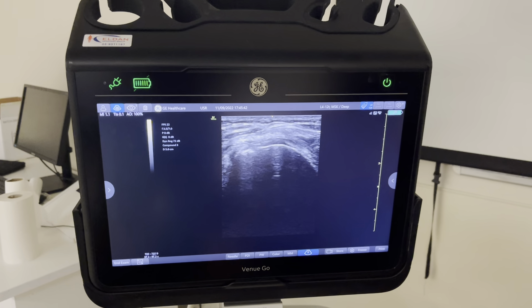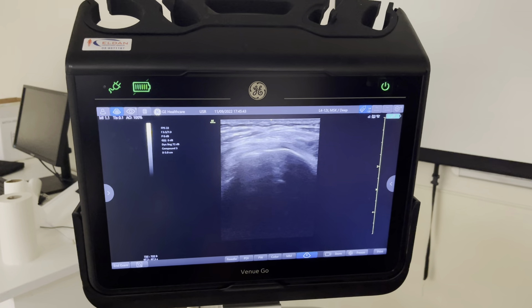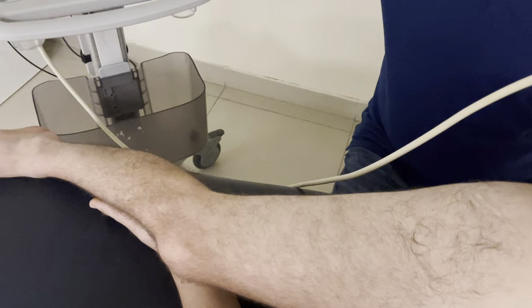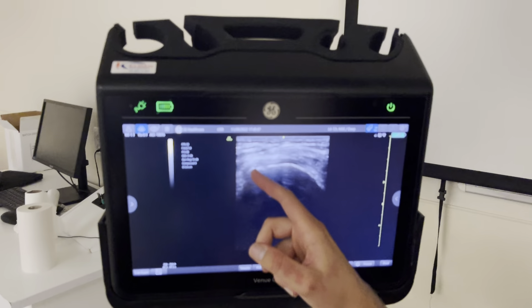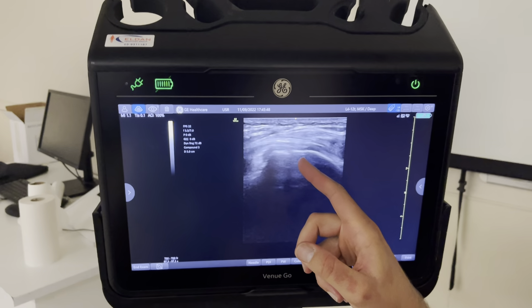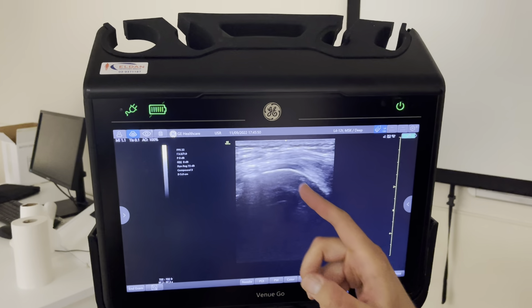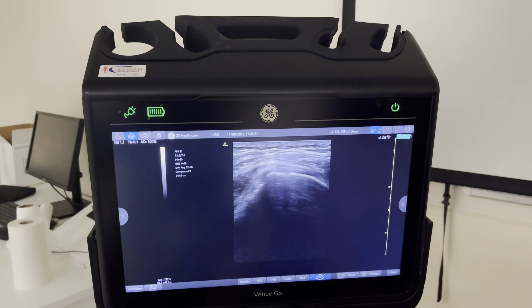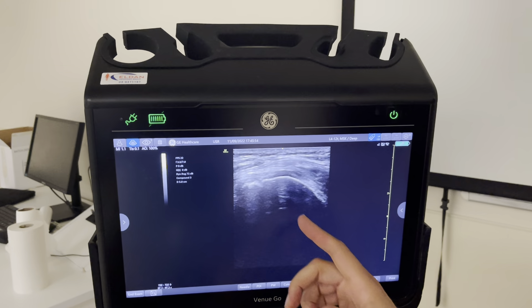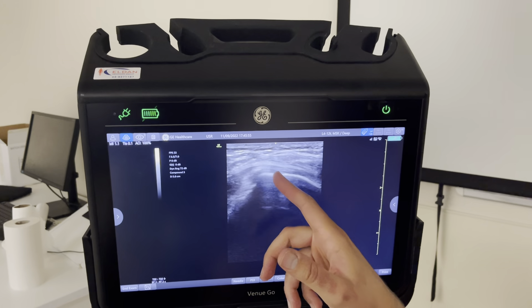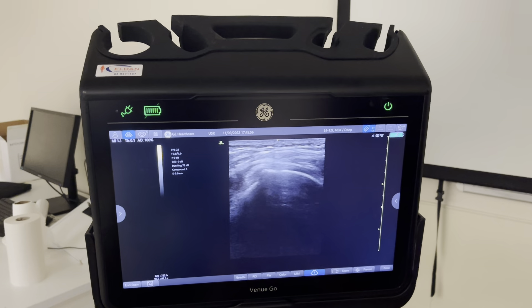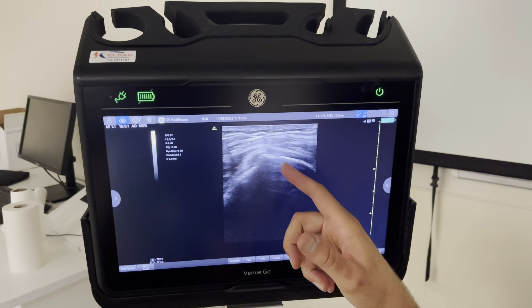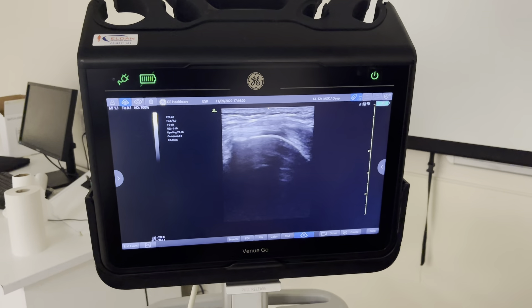With a little internal and external rotation, you see that the tendon is moving together with the bone. And this is the iliotibial tract above it, and that stays in place. So sometimes in a static image it's difficult to see. You just do this trick and you see that everything that's moving with the bone — that's all tendon tissue.